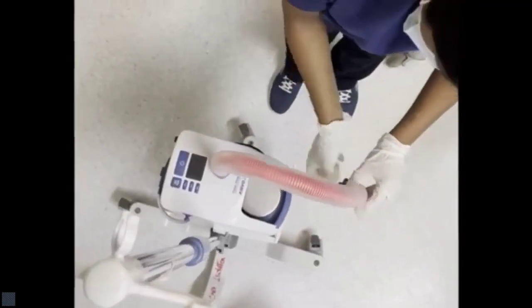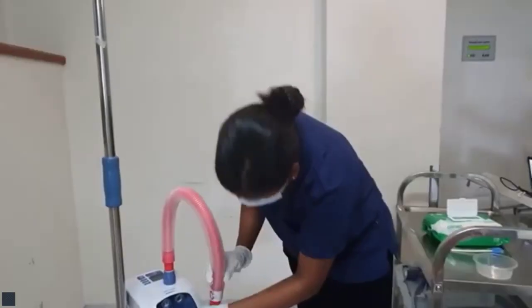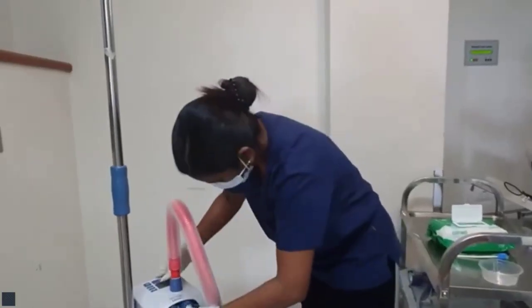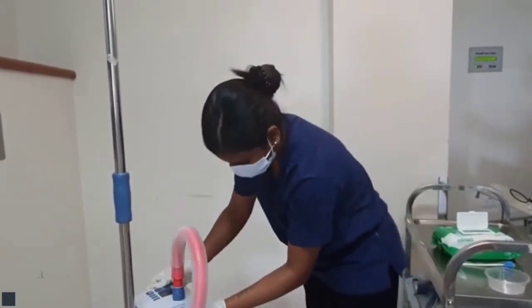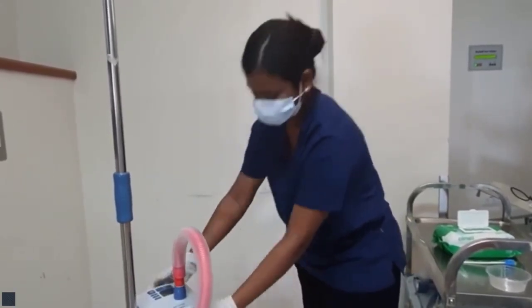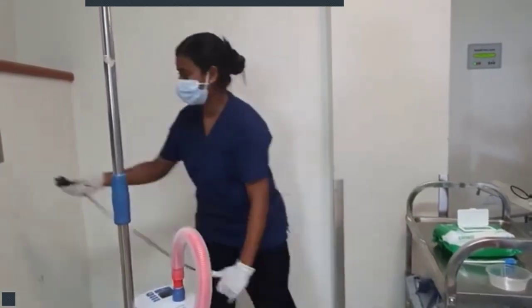Insert blue filter cap onto the right port. Once you've connected the red disinfectant tube, you may now turn on the machine, pressing and holding the mode button for 3 seconds.